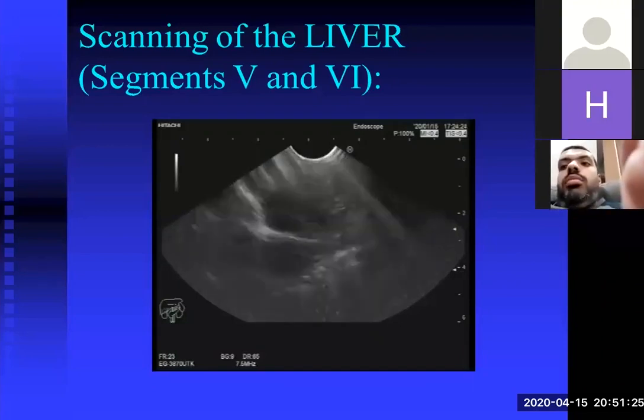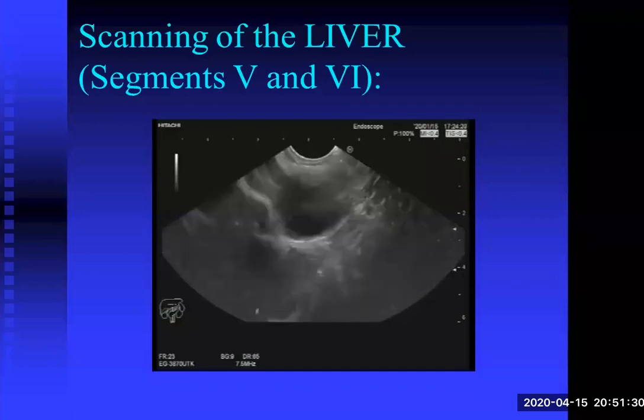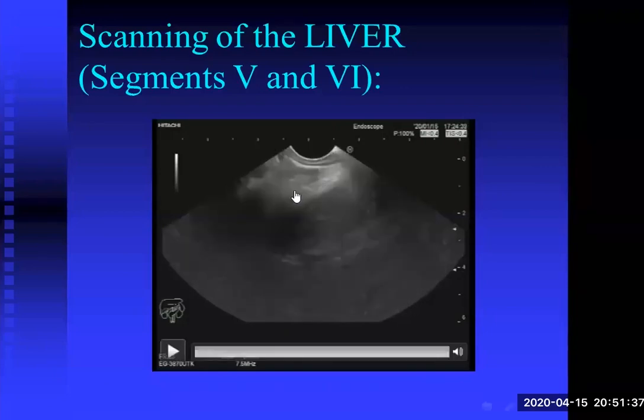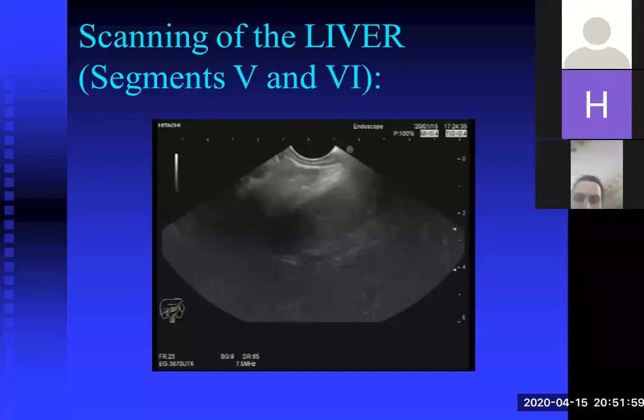So it is very important to examine the liver, and we are now running a big multi-center study of examining the liver thoroughly in cases of intra-abdominal malignancy, especially pancreatic malignancy and GI malignancy, esophageal, gastric, and duodenal, searching for minute liver metastases not seen by CT or MRI.